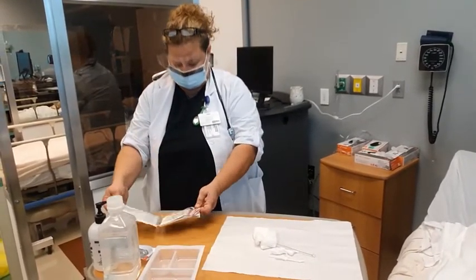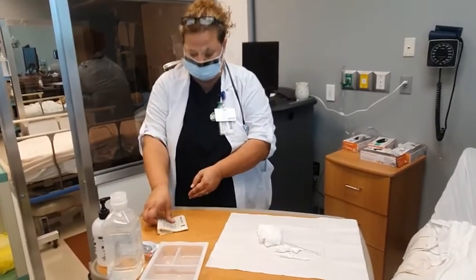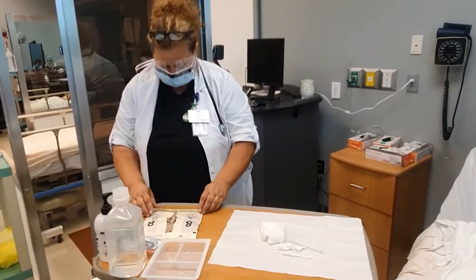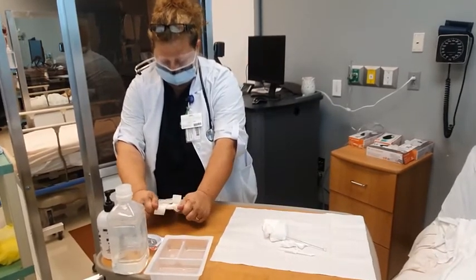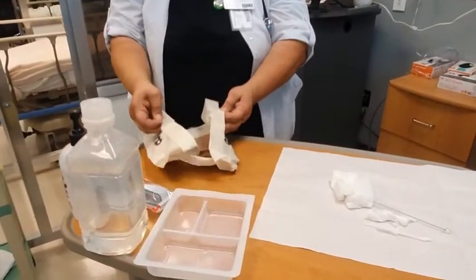So you'll open up your gloves. And again, when you're opening up the gloves, make sure you do all the little bends, because if you do, then it won't flip back on you. Open it up from here.